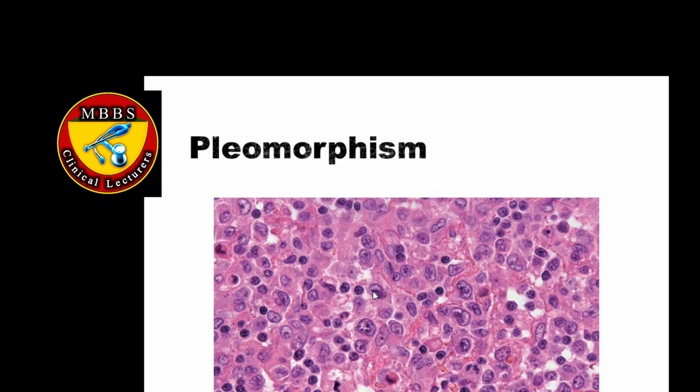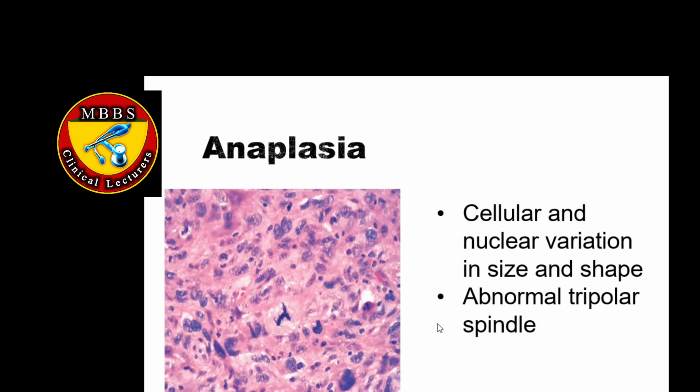You can also notice a good mitosis over here. And then you can see smaller, these are prominent nucleoli, more than 1 nucleoli also. Look at this shape and size. This is a mitosis over here. So lots of pleomorphism in this slide.